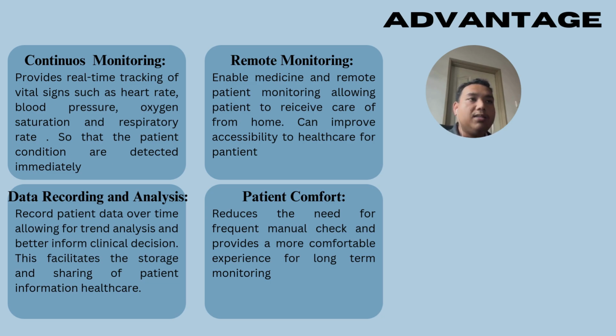And third, remote monitoring. It enables remote patient monitoring, allowing patients to receive care from home. This can improve accessibility to healthcare for the patient. The fourth is patient comfort. It reduces the need for frequent manual checks and provides a more comfortable experience for long-term monitoring.